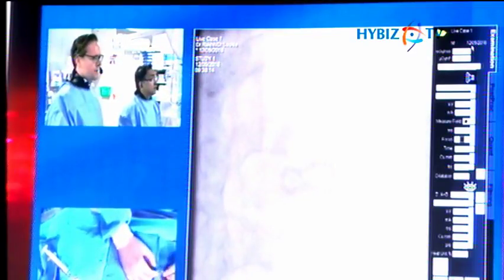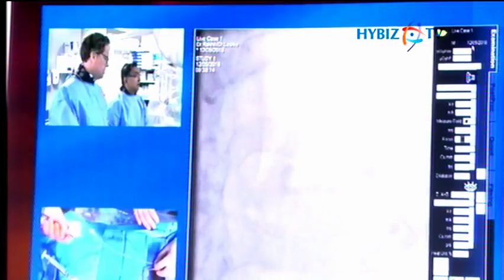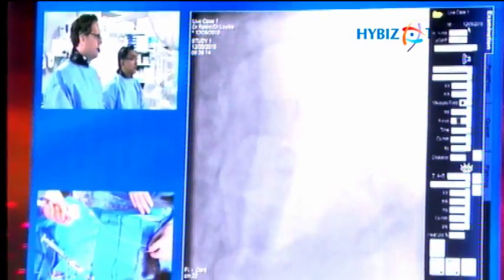And then in terms of the sizing of the device, are you just trying to obtain apposition? So you're sizing based on the lumen, or with this device would you size it more conventionally with a media-to-media type measurement? Yeah, we look at the distal and the proximal reference areas, and we size it according to there. We've got a 3.5 distally, it's down from 6 atmospheres. And we then look at the proximal reference, and then we look at the length.